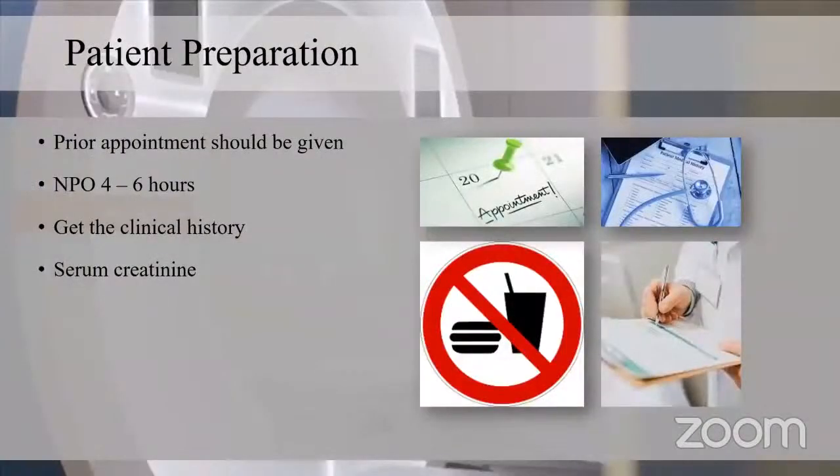Now, moving to the patient preparation, here an appointment should be given. The need for this appointment is that the patient won't feel happy waiting in the radiology department. Even if they are waiting in the ward, the hospital room, or their home, they won't feel that much discomfort, but they'll feel a lot of discomfort when they are waiting in the department.